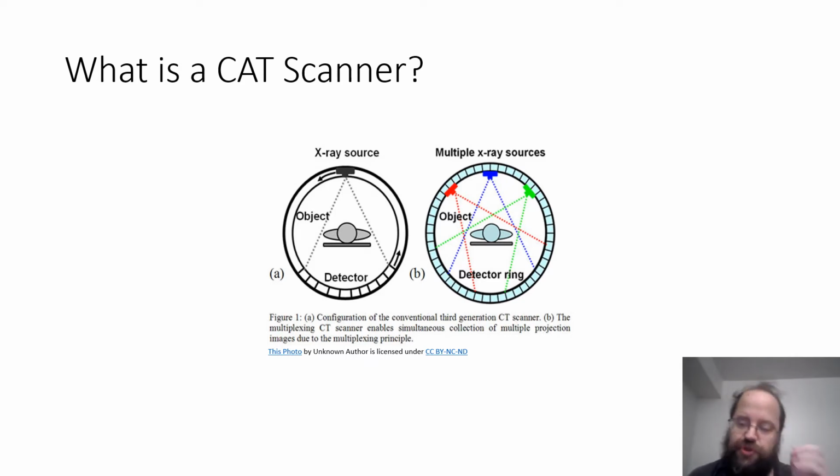Now, the modern ones use multiple low-energy X-ray sources, and so the receivers, which are all over the patient, you just have to move the receivers a tiny amount. You'll hear the spinning sound as the X-ray guns are moved, but they don't have to move as much. And most of the movement that's taking place is the table you're laying on as you slide in there, and a couple quick snaps, if you will, and you've got the image completed in 30 seconds with the new high-speed X-ray imaging for these new CT scanners, because it's multiple beams.